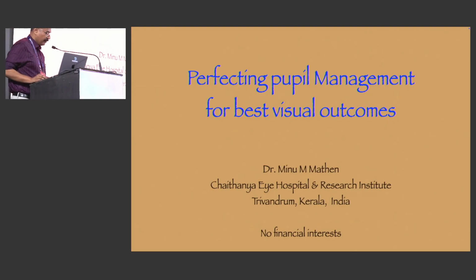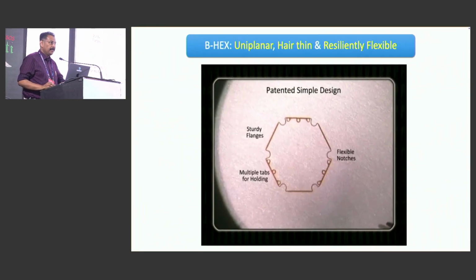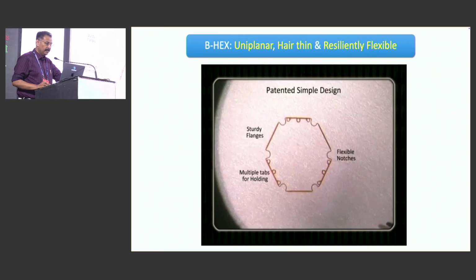Good morning, everybody. Thank you, Sony, for this opportunity. So, pupil perfecting, making them big and small. You know, we don't need them small, and we don't need them too big also. So, this is the one go-to device which I am using now.